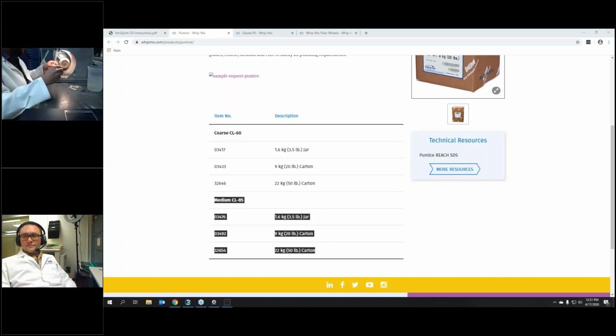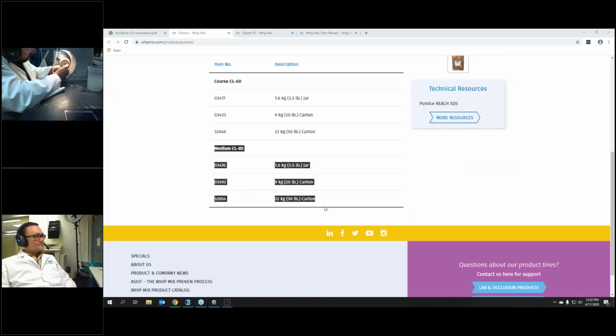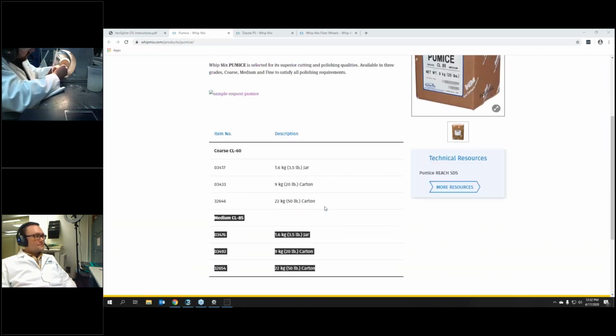All right. So it's starting to look pretty good. I keep just a little cup of water, and if I'm doing a batch of them, I just put them in there while I wait for the next step. And so let's go ahead and do this one here. Now this is the one that Evan designed. The first one was actually a sample for a customer. So Evan's had a little bit more detail on it. So I'm going to go ahead and try to work that out.